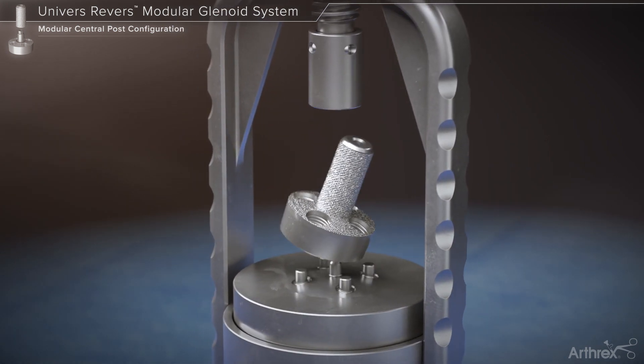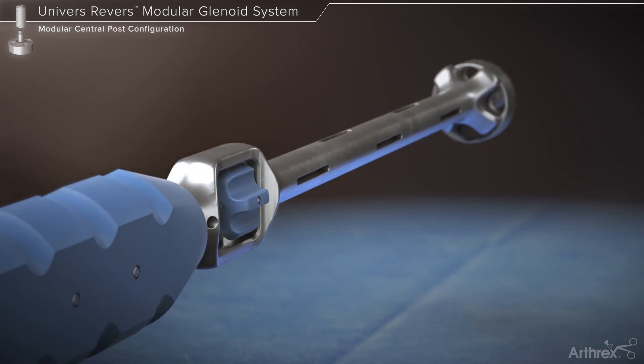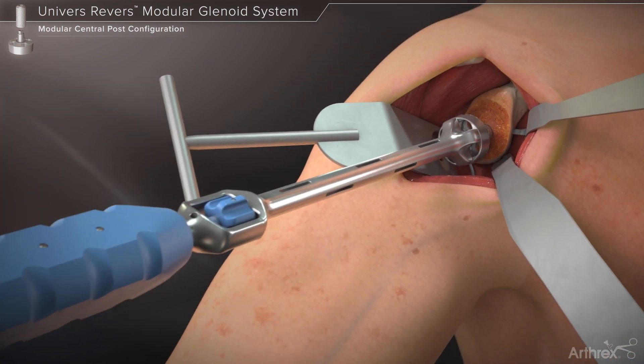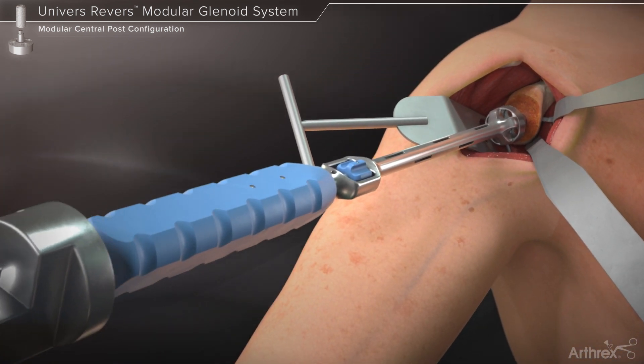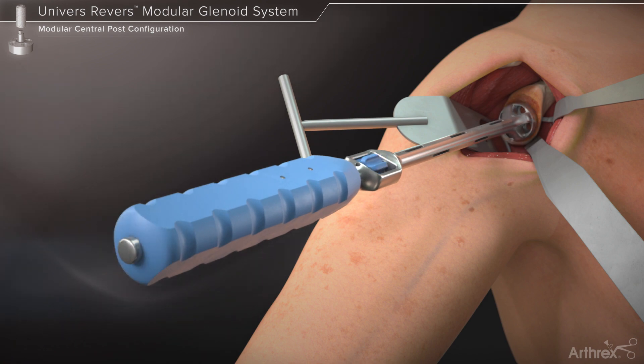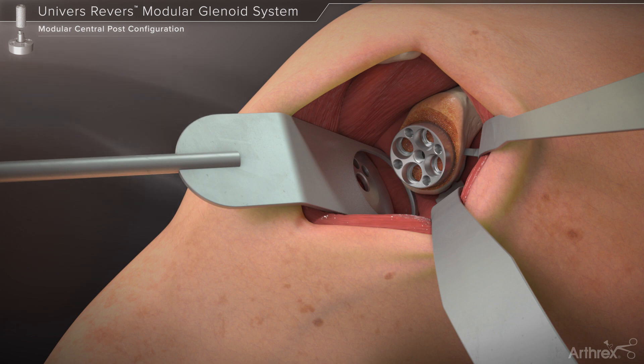The base plate is then removed from the press and placed onto the threaded base plate inserter. The base plate is impacted into the glenoid until the base plate is flush to the prepared glenoid surface. One may choose between placing locking fixed angle 5.5 mm or non-locking 4.5 mm variable angle screws within each of the peripheral screw holes.